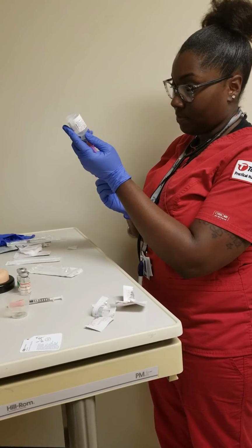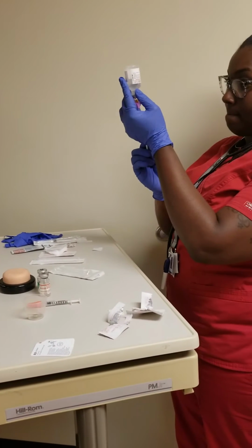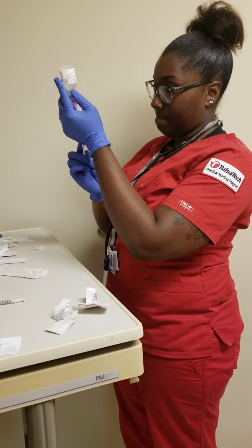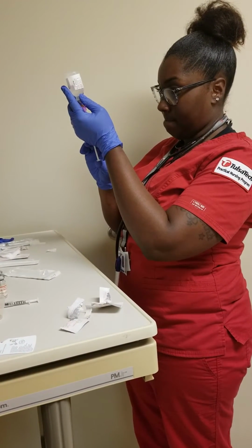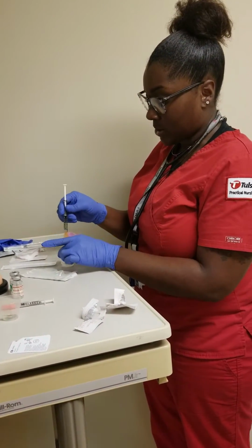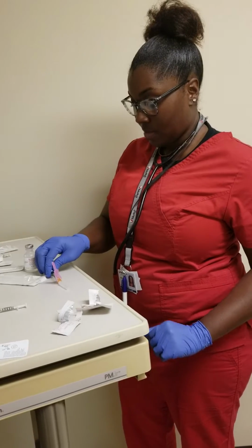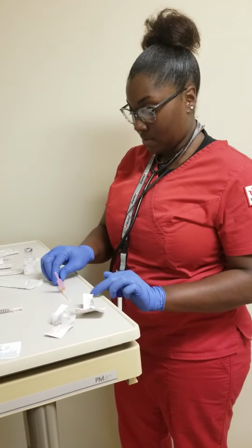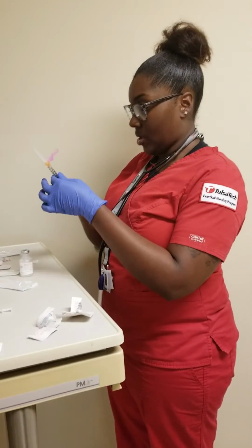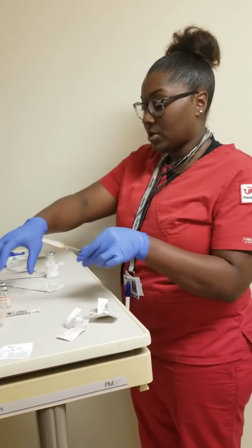So that it doesn't create a lot of pressure. Okay. So I have my 0.5 that was ordered by the physician. I'm going to cap this up. I'm going to label this as well to make sure that nothing gets misplaced or given to the wrong patient.